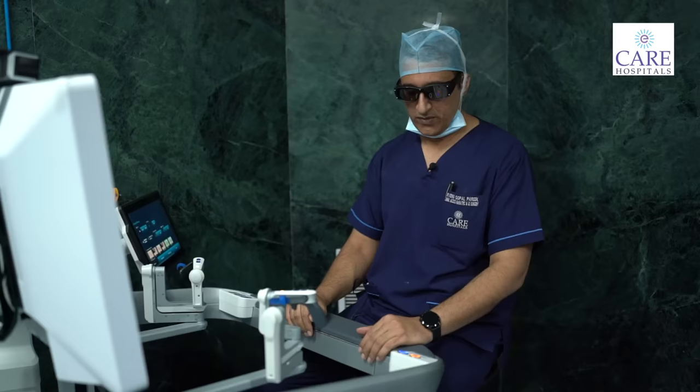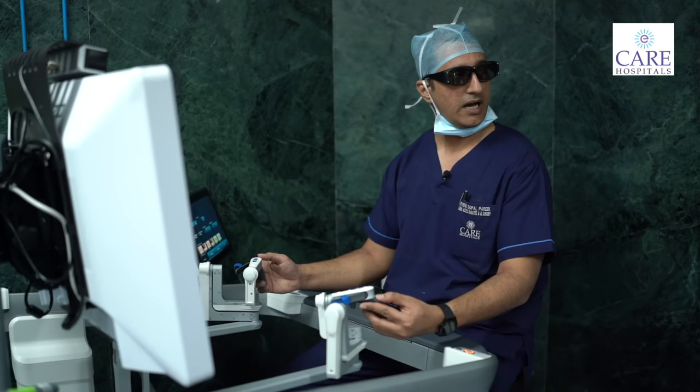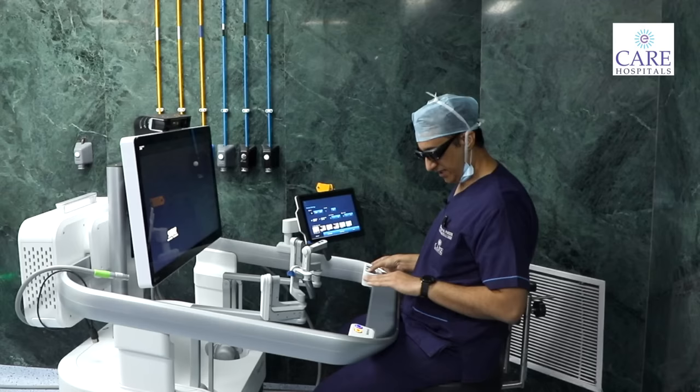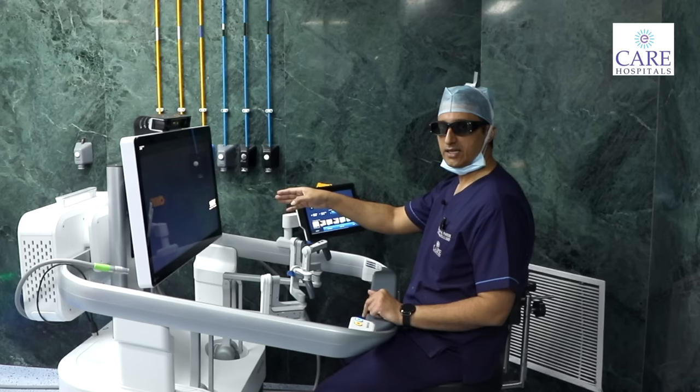So now if you see, these are the operating arms, two arms which I have, which are equipped with IR lasers so that it guesses my arm movements, so that if any false movements happen, it will be sensed. Only the surgeon's robotic arm movements will be registered. I can adjust the height of the console by these buttons. It has a lot of safety features in it. Then you have the screen over here, which is a nice full HD screen, which will give a nice 3D inside view of the robot.